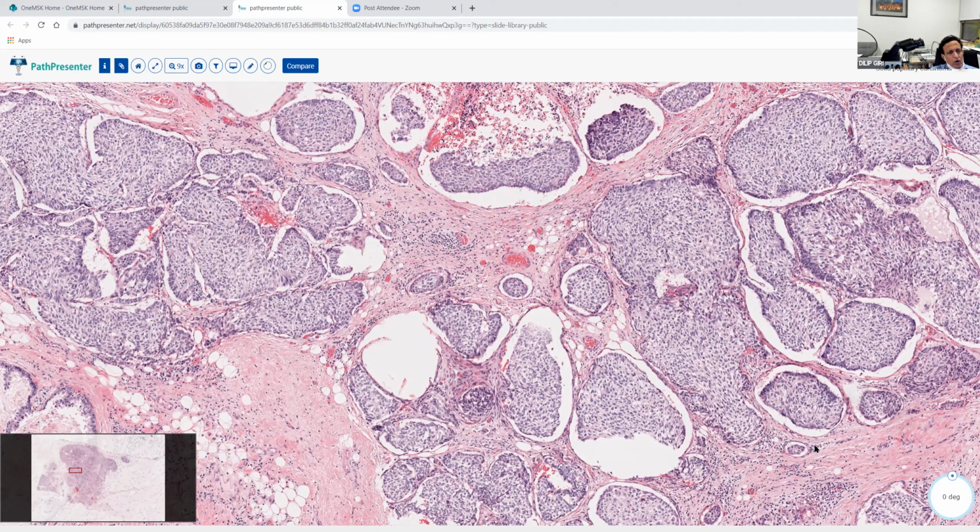So we can again talk, for the benefit of people who were not participating with us last time, about the use of myoepithelial stains in the setting of encapsulated papillary carcinoma. These stains will show you that the encapsulated papillary carcinoma has no myoepithelial layer. But that should not be the ground for making the diagnosis of invasion.